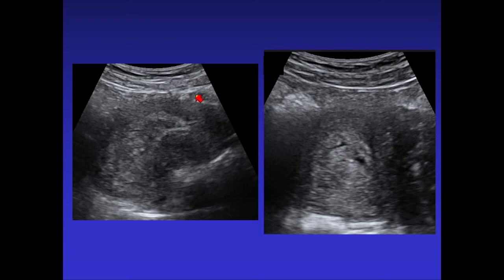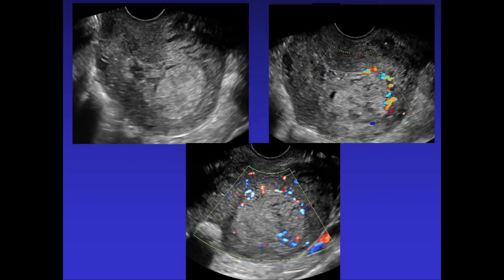We frequently start with a transabdominal scan. If patients have had a C-section, they might have a big dressing on their abdomen, and since you're going to go transvaginal anyway, there's no reason to remove that dressing. We do take transabdominal images just to make sure we're not missing anything large. You can frequently see heterogeneous contents within the endometrial cavity — the question is whether it's blood products or retained products. On vaginal scan of this retroflexed uterus, you can see heterogeneous material, and when you turn on color Doppler, you can actually see flow going into the placental tissue, confirming it as placental tissue.